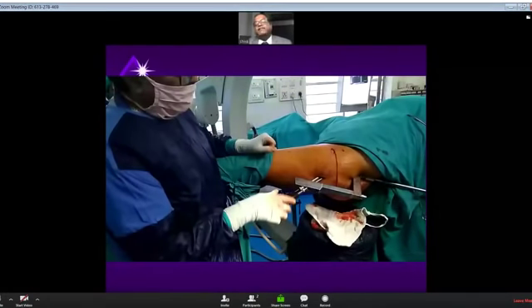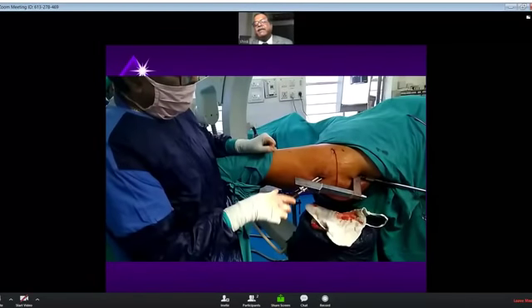How do I compact this fracture? As I said earlier, after I pass the guide wire and the nail, I release the fracture slightly. Then I pass the superior screw first, and then I pass the inferior screws halfway through. Once I pass the superior screw halfway through, I release the traction. I compact the superior screw first. See that the length of the superior screw is proper. Then I will use the inferior screw accordingly.